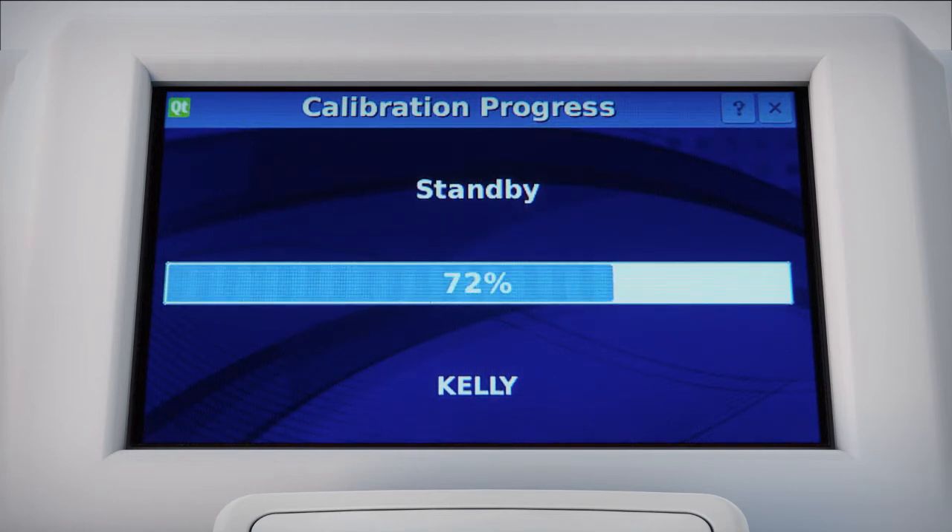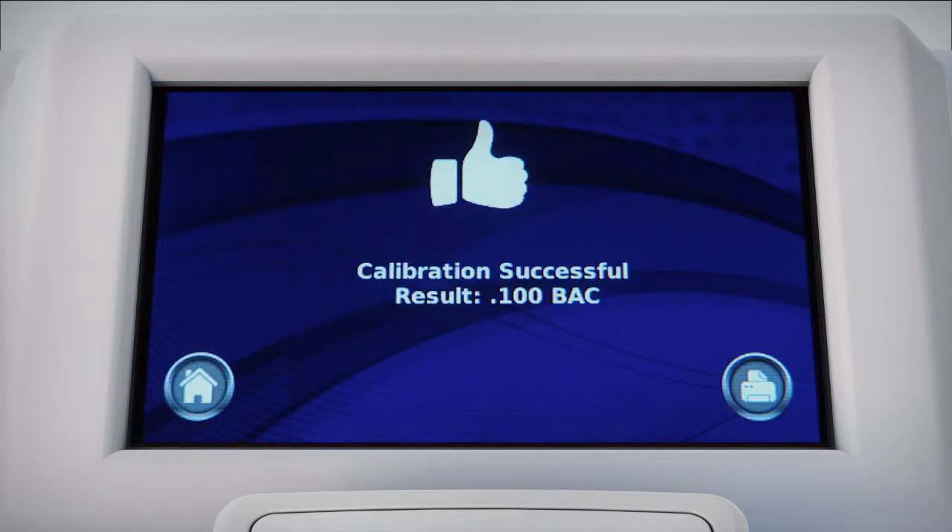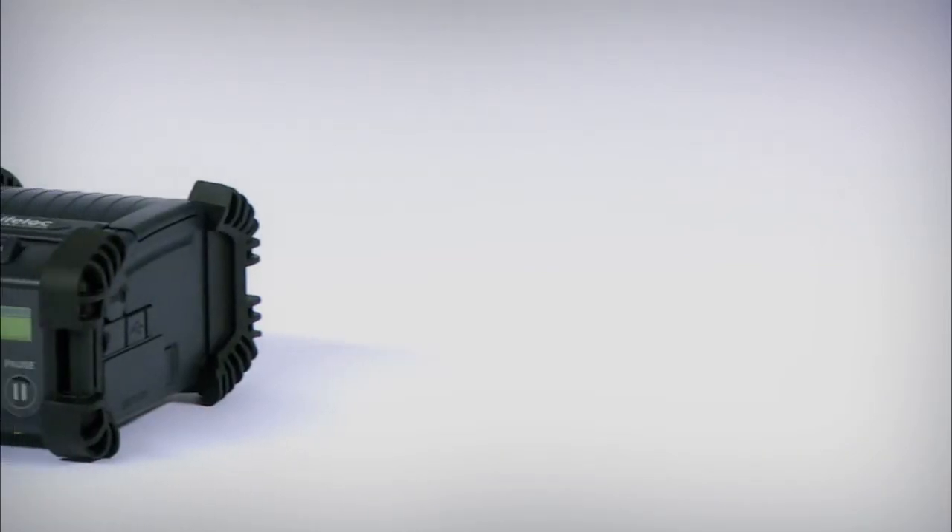The progress bar shows real-time calibration status. The system knows to automatically perform a calibration check after each new calibration. When calibration is completed and checked, the results are displayed and printed.